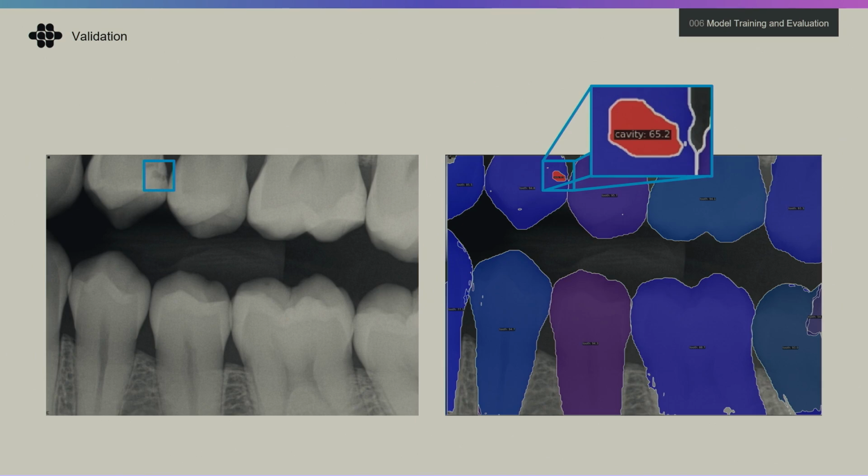And this can be seen here in the one actual cavity we have in our validation set, where the cavity is being predicted, the shape is relatively accurate. Confidence value is only 65%, but it's differentiated from the false positives. So this is indication to us in these early stages that yes, we can train the model to understand these things, and through the course of additional iteration and fine-tuning of how we represent the data, we can improve these results and have a more effective pipeline.